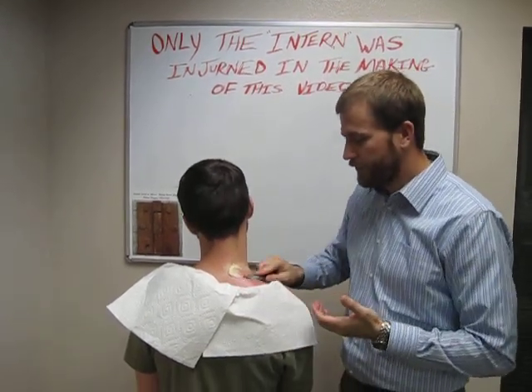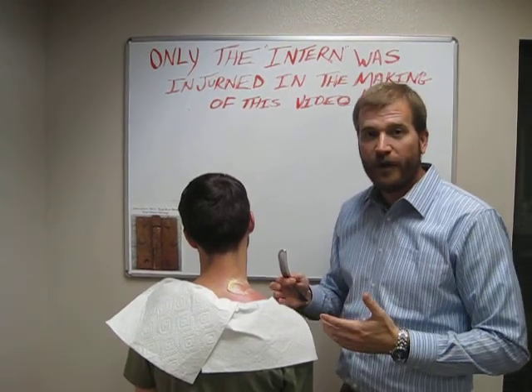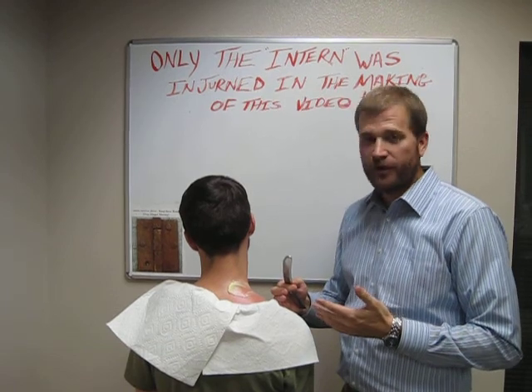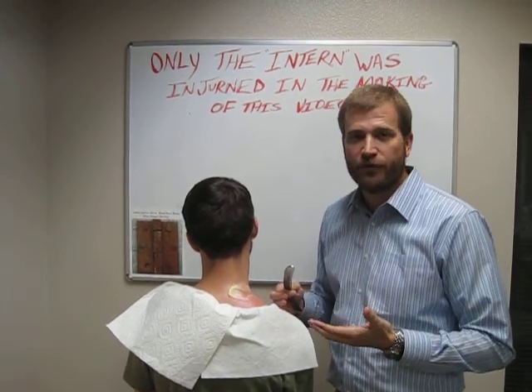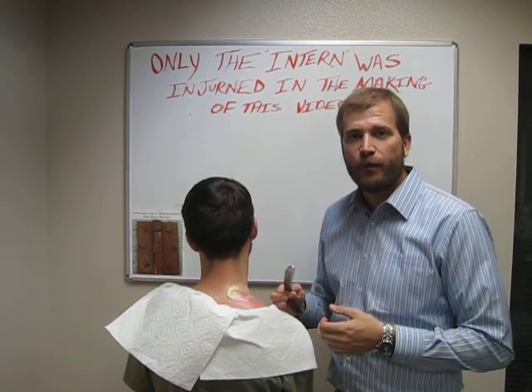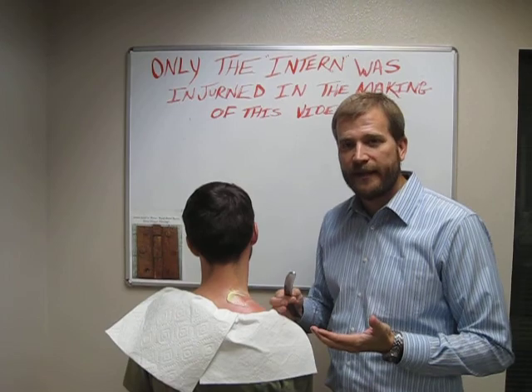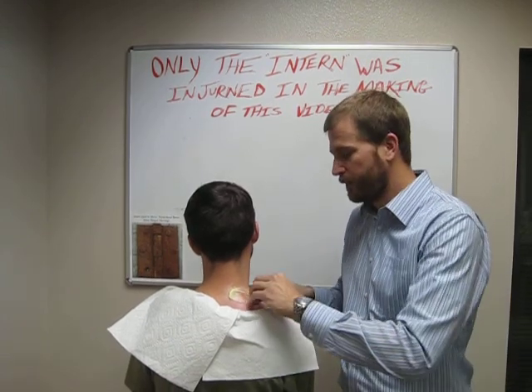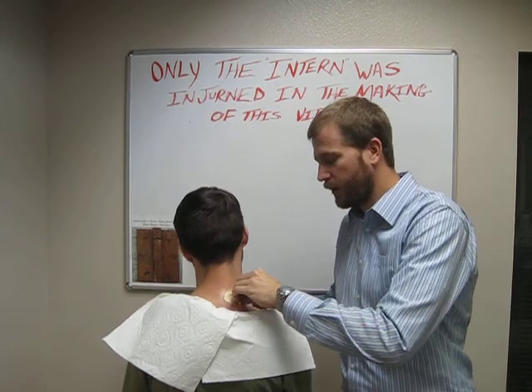Alex has volunteered to be our demo today. We are applying cocoa butter so we can slide along the skin without pain. We've already talked with him that we're not trying to hurt him — we're just trying to work the muscle as deep as we can. We always want it to be comfortably tolerable, so on a scale of zero to ten, that's a three or four. As we slide along, he's going to tell me if I get above that three or four mark.